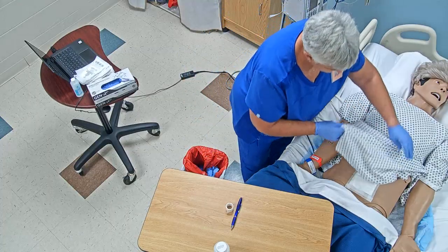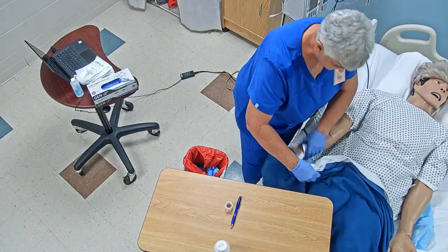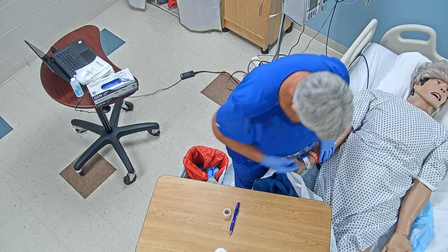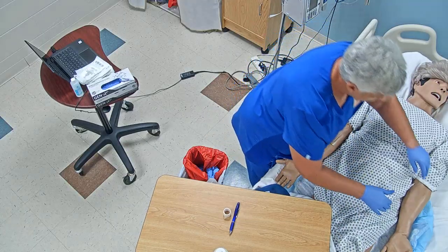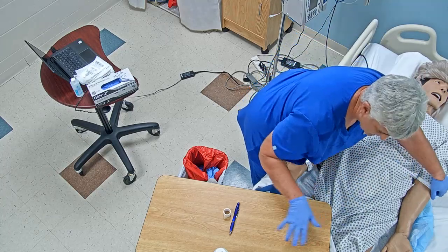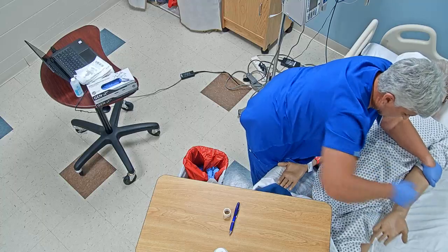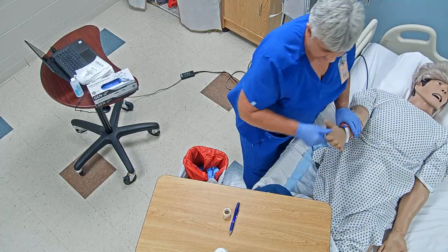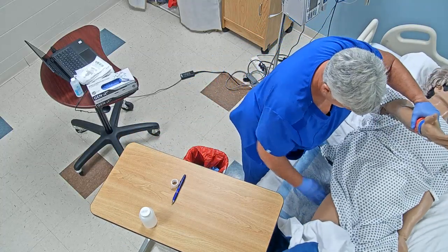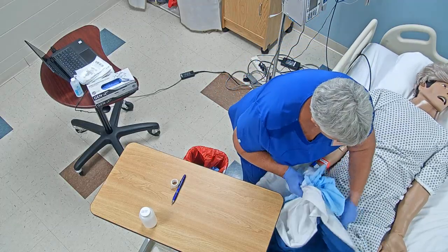Get that patient covered up. These gloves are clean. I just touched the outside here. So get my patient cleaned up. And we're going to go ahead and remove that blue pad. And possibly, so these were just touch the outside, so it's not contaminating anything. And I'm going to go ahead and turn, and if we needed to have help, and let me get this out of the way. Bend that knee, okay? And I would need to put a fresh one underneath there if we needed to, making sure all the drains.